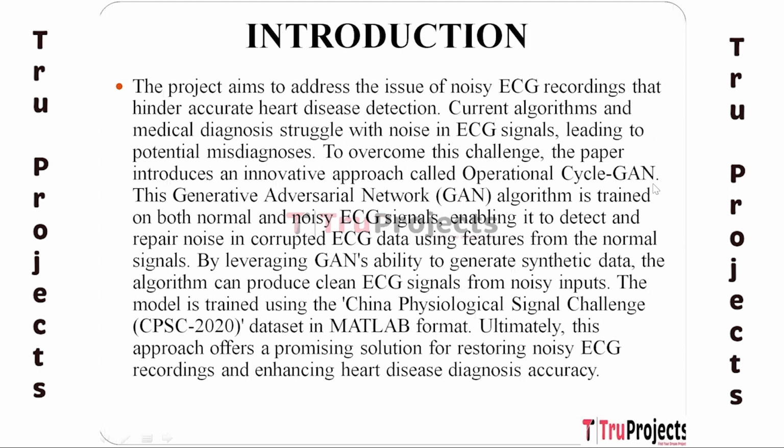Introduction. The study highlights the difficulties in effectively identifying heart arrhythmias using ECG recordings due to abnormalities such as baseline drift, signal cuts, motion artifacts, decreased QRS amplitude, and noise. The study provides a unique approach for blind ECG restoration that uses cycle-consistent generative adversarial network, cycle GANs, to restore the genuine ECG signal distorted by such artifacts to a clinical level ECG, regardless of the type and severity of the artifacts contaminating the signal.